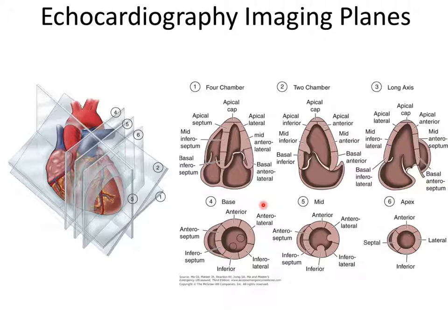Because of digital imaging, you have a 3-dimensional digital representation of the heart, you can view it from many different angles, right? We can view it from the base towards the apex. We can review it from the anterior towards the inferior, etc. So it's important to know these orientations and always display your data in these orientations. Otherwise, people will get confused, right?